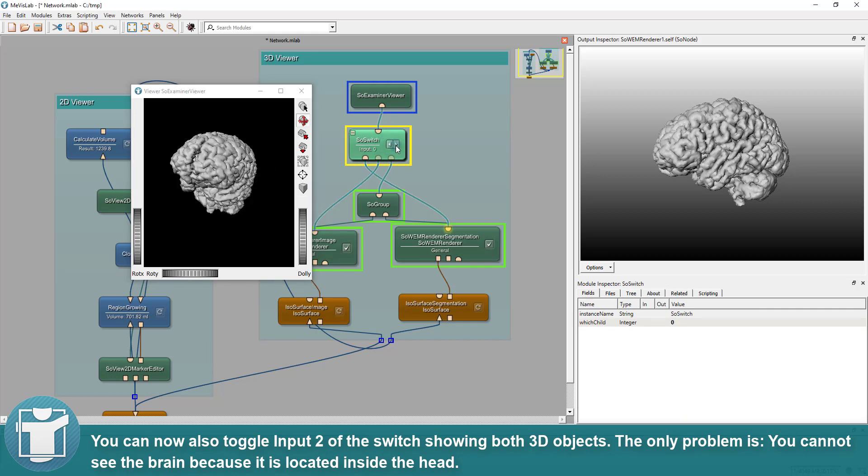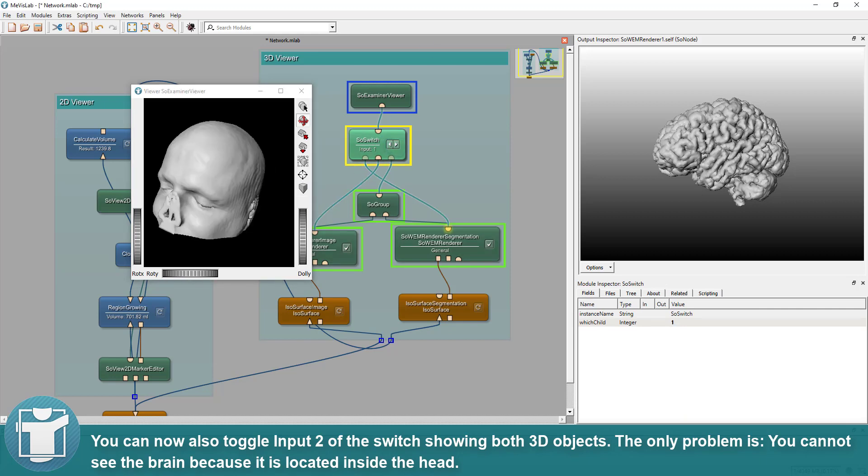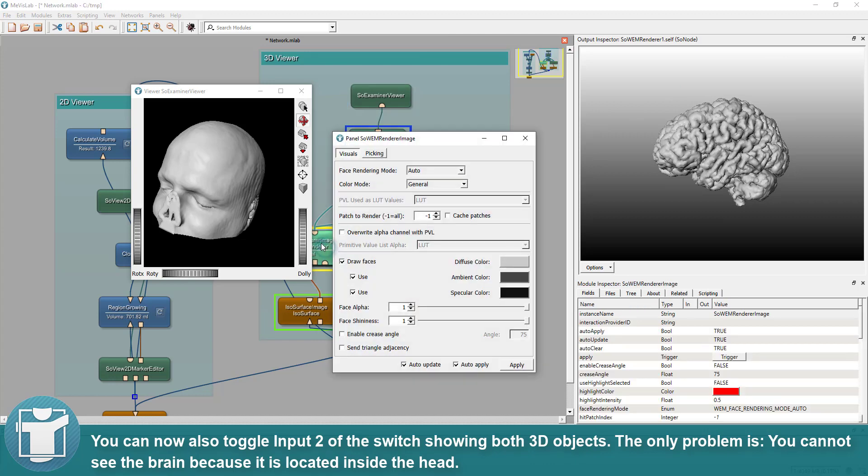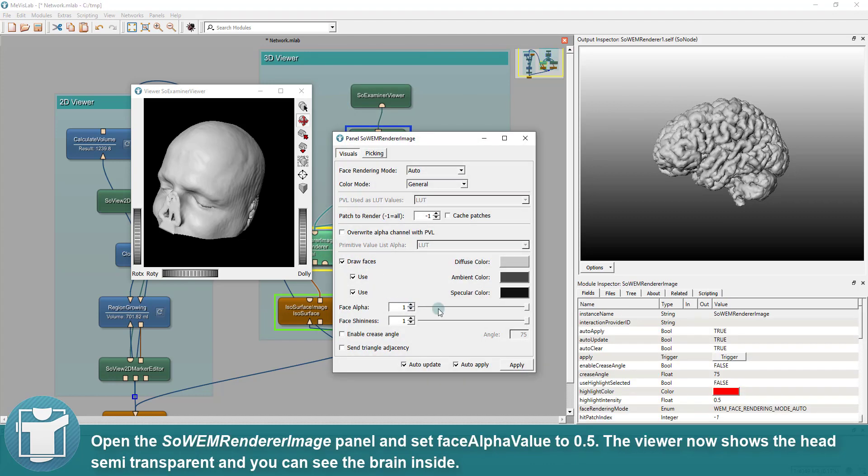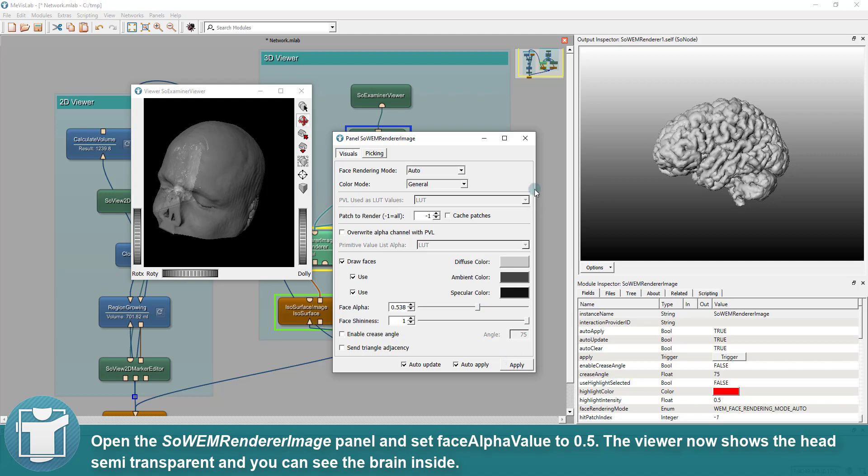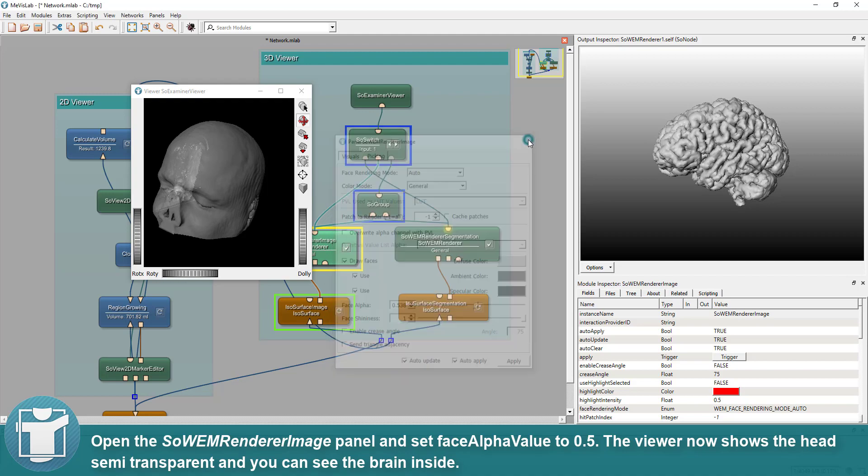The only problem is, you cannot see the brain because it is located inside the head. Open the SoWEM renderer image panel and set Face Alpha value to 0.5. The viewer now shows the head semi-transparent and you can see the brain inside.